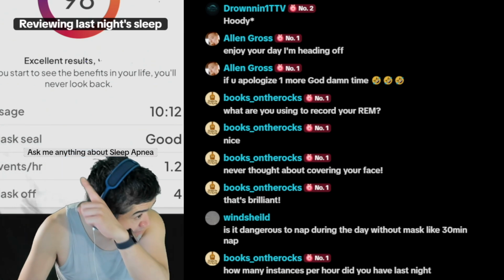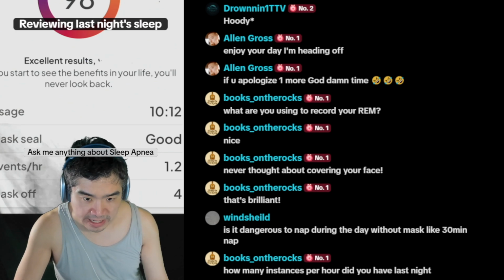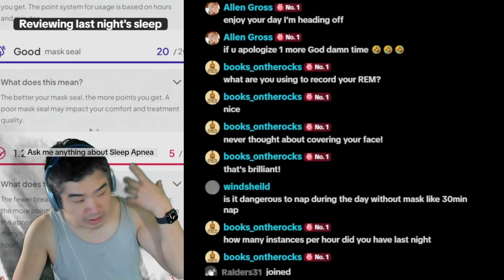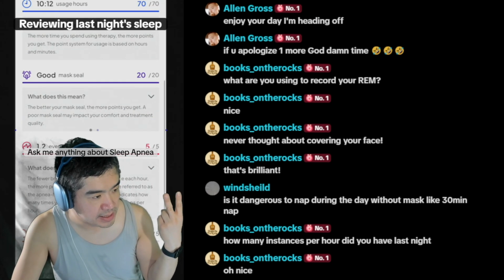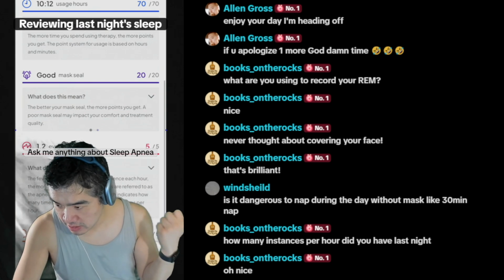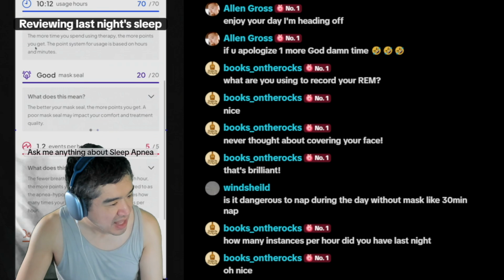Events per hour 1.2, so that's pretty low. What else? Yeah, and the only thing that docked me 2 points was the mask off, and again, that's explainable. I couldn't sleep for the first hour, so I took the mask off once, maybe once or twice, and then the nap, and then once more at the end of the night, this morning when I woke up. So there's my air stats.